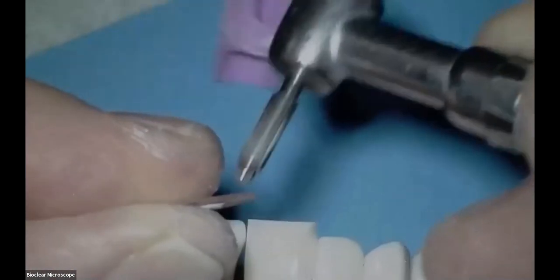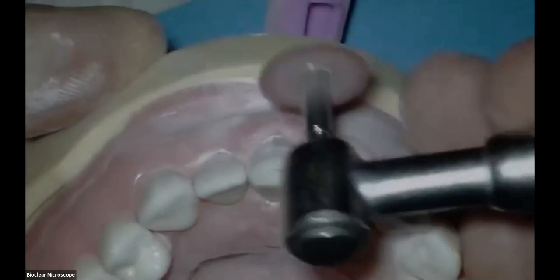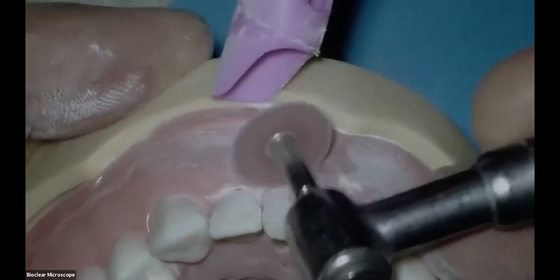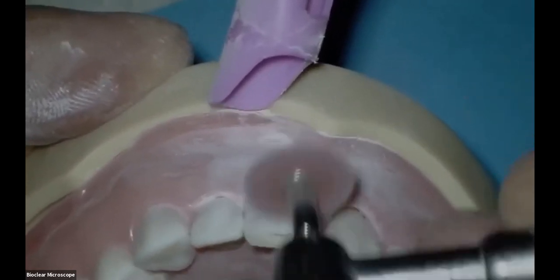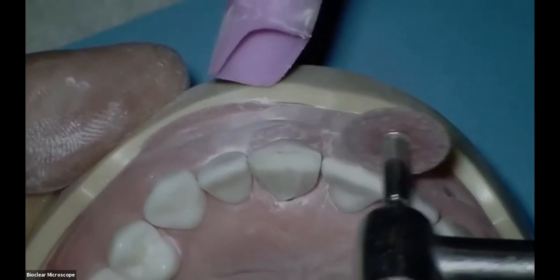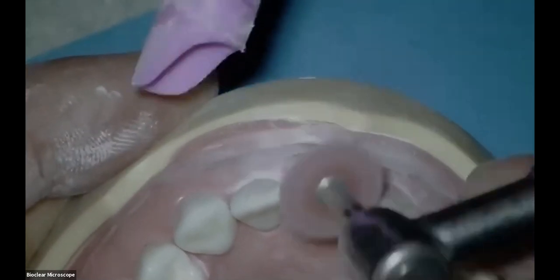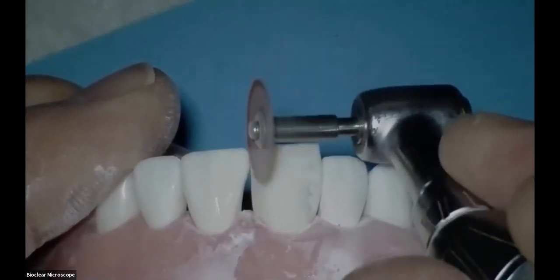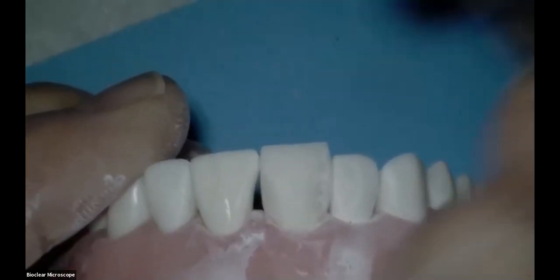Then we'll bring the disc in the inverted position. I'm going to roll it like this. So in a case like this, I'll be veneering over the facial, leaving about 0.5 to 1 millimeter of composite. Slow the disc down. We're going to round our incisal embrasures.